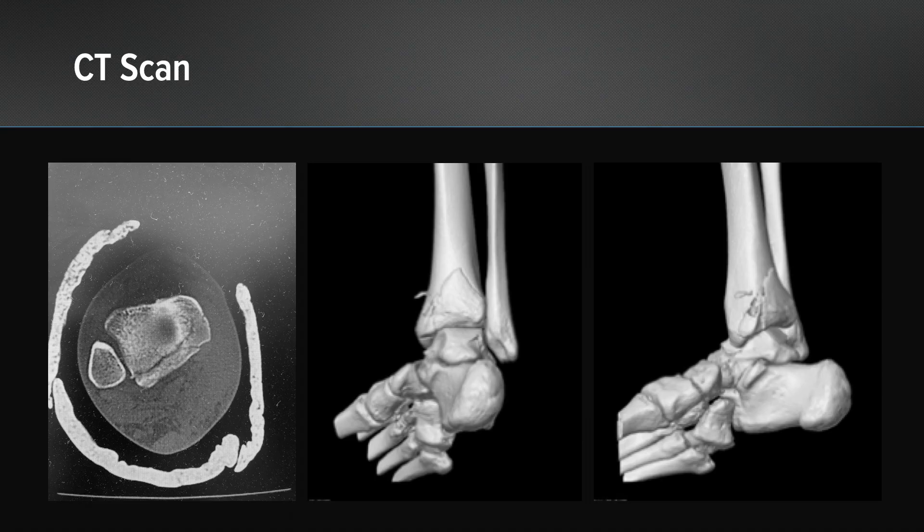This is what the CT scan shows. It shows that large posterior malleolar fragment with some level of comminution. You can see how high up it extends on the CT scan and how medial it extends as well.